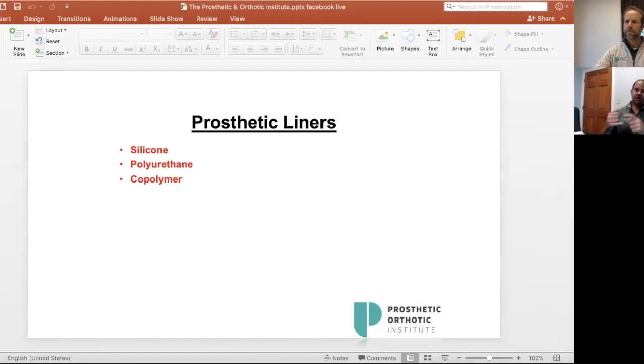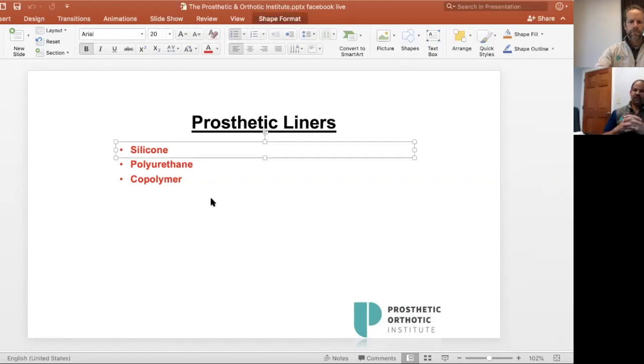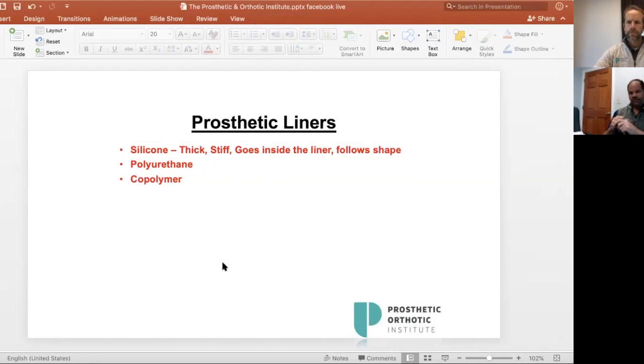The properties of silicone are that it's thick, it's very stiff in durometer, it's more of a funnel. We're going to put the residual limb inside of the silicone liner, and as a result, this kind of forces the residual limb to follow the shape of the prosthetic liner. Who is this liner predominantly placed on? Our below knee and above knee amputees who have really no secondary issues with diabetes, or any wounds that we're concerned about. We really have to have a nice firm residual limb for this type of liner.